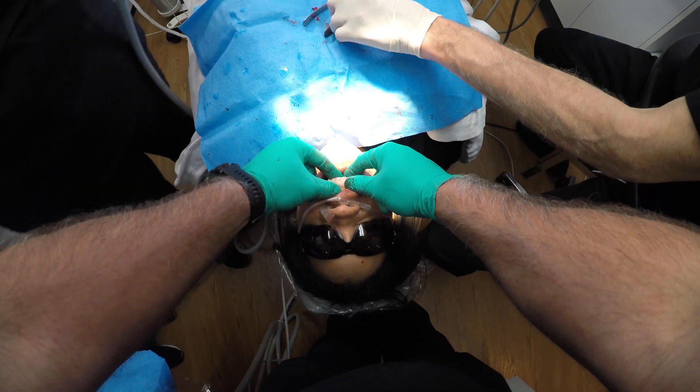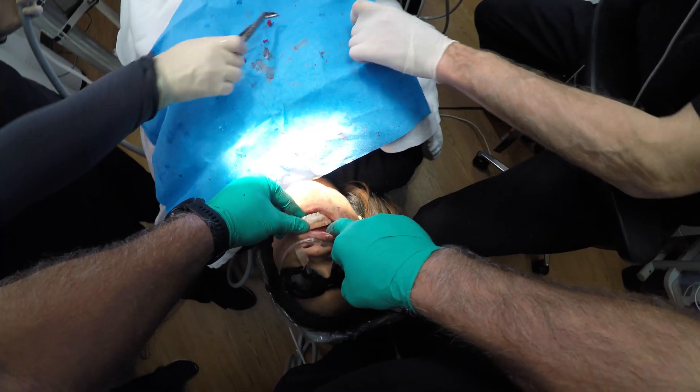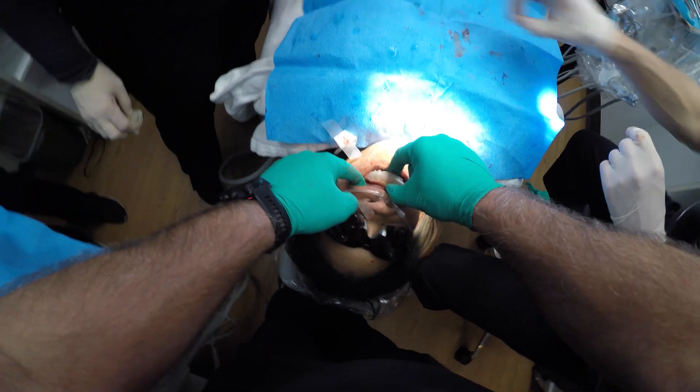We removed a lot of bone to facilitate the appropriate restoration. We can see that the reduction has been made, cleared beyond our freehand template bone reduction guide on both sides. So we have the reduction that we need in good shape.